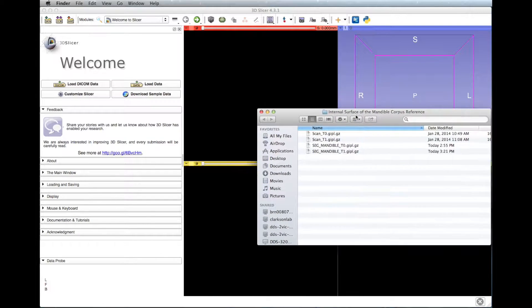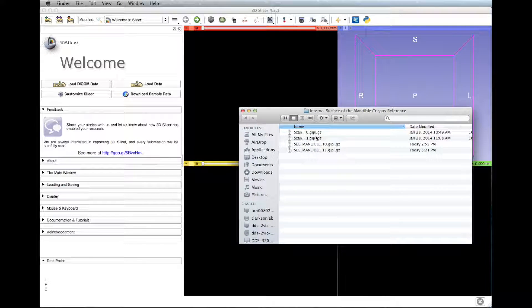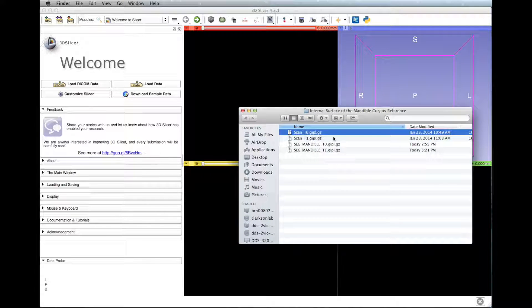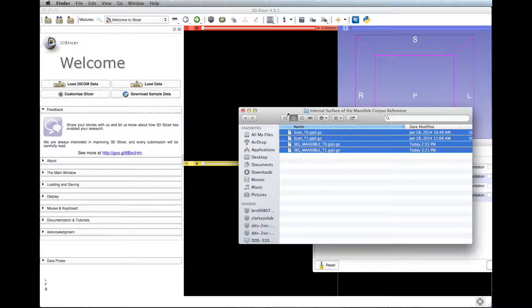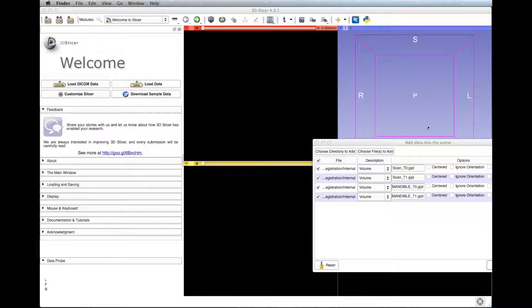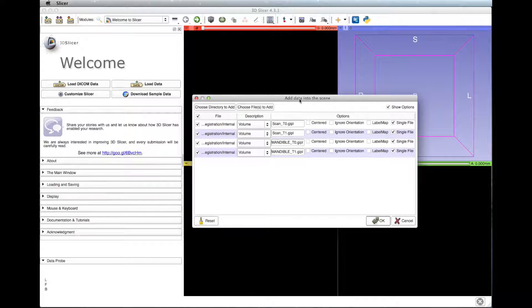Load the T1 and T2 scans, T1 and T2 mandible segmentations, and select the option Centered for each of the files.